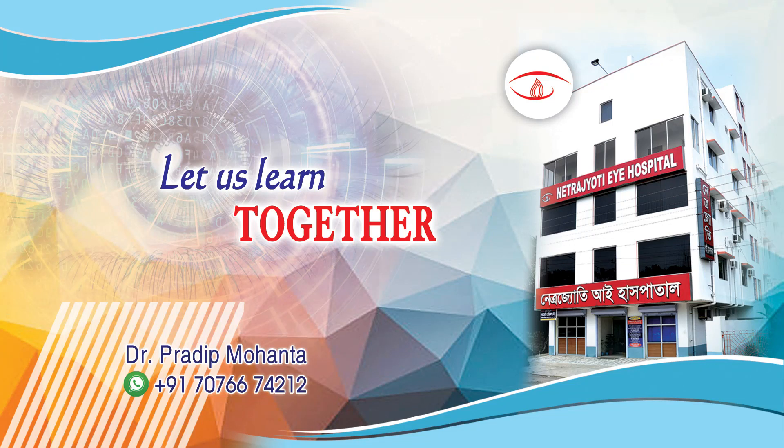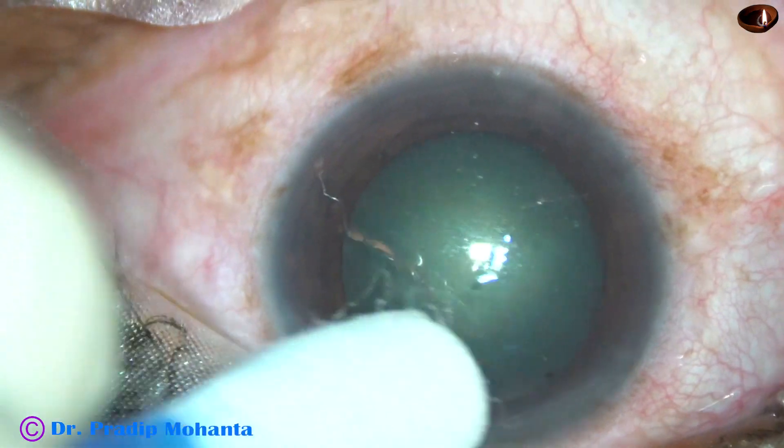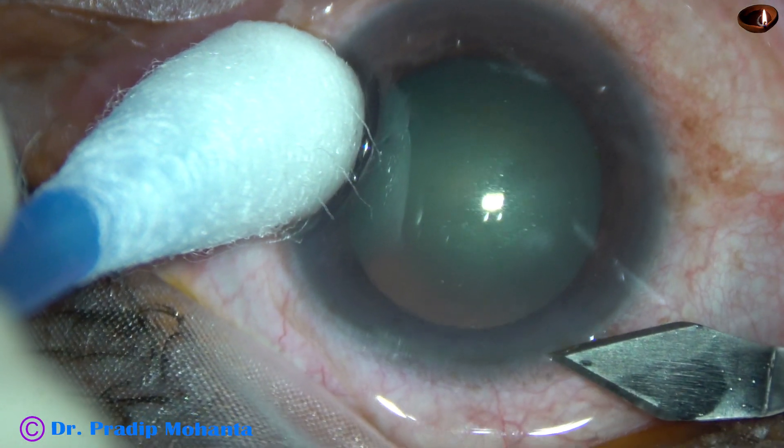Friends, welcome to my workplace at Ranaghat, West Bengal, India. In this video, I am going to show two routine phaco surgeries. This is the first case.